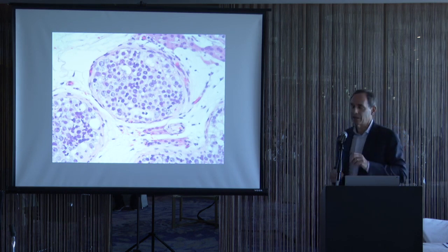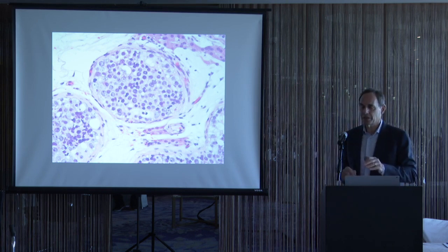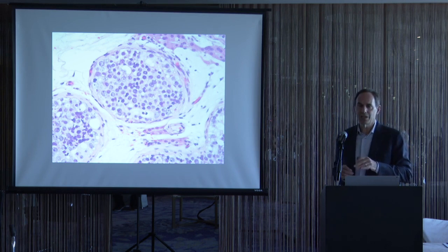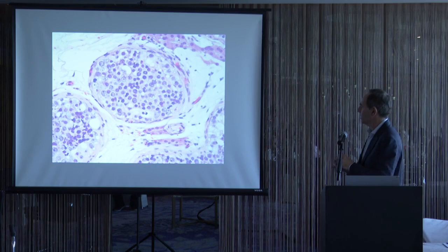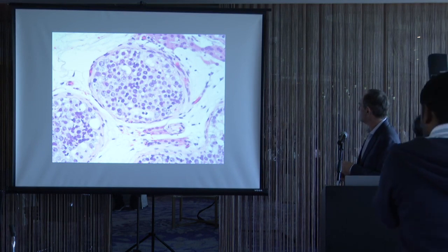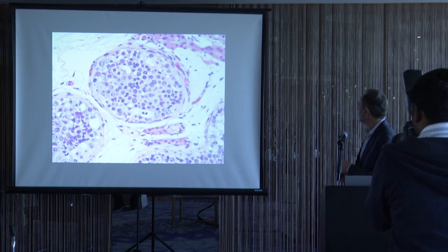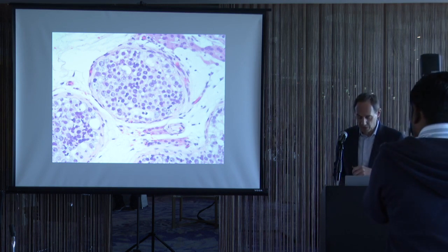Now, as you recall, I said you do not get germ cell neoplasia unclassified type in spermatocytic seminoma. But what you do see is intratubular spermatocytic tumor. So the distinction is you don't see those cells that look like seminoma cells as a single cell layer around the outside of the seminiferous tubule, which is what you see with germ cell neoplasia unclassified type. What you see are the classic cells of spermatocytic tumor, speckled chromatin, the small erythroblast-like cells, filling up seminiferous tubules. That is acceptable for a spermatocytic tumor and not uncommon.